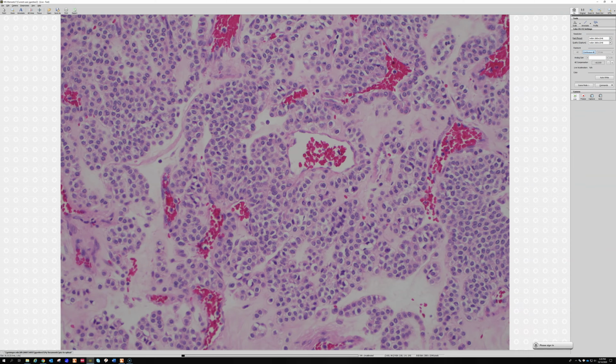These are perivascular cells, but they're not endothelial. So they're going to be negative for CD31, ERG, and CD34 usually. And what they'll express is actin, smooth muscle actin, because they're pericytes, modified smooth muscle. Usually they're desmin negative, but they stain with actin. Although in my experience, the actin is not always diffusely strongly positive. It can be kind of patchy.